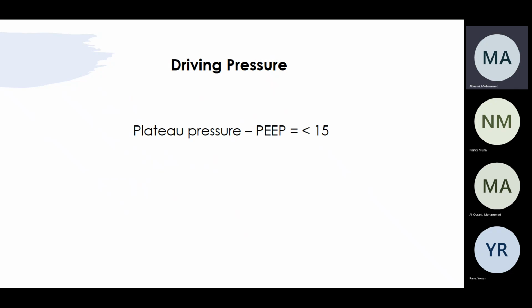But if I say, you know what? Let's just increase the PEEP a little bit. So what will limit my increase in the PEEP? What things do you look at? The peak. So I went up to 12, and his peak went up to 29. So what limits your PEEP, the plateau and hemodynamics? Okay, you're right. What do you mean? If you increase the PEEP, the plateau will go up sometimes.